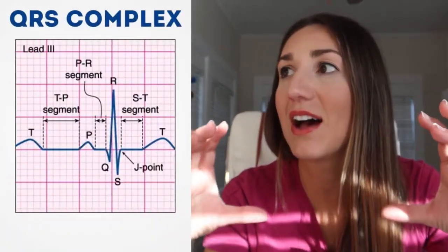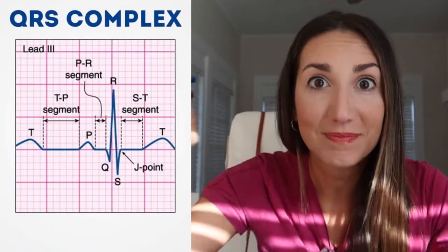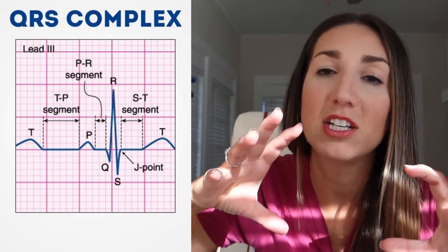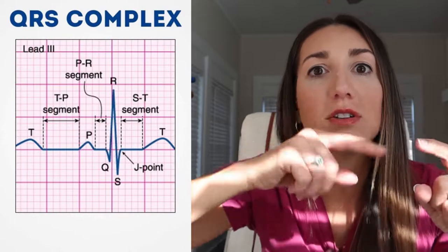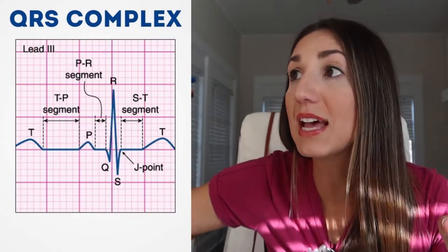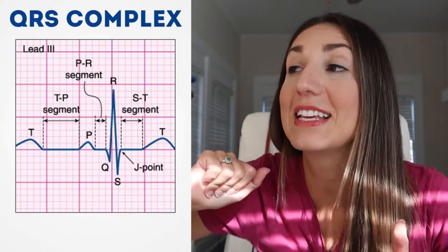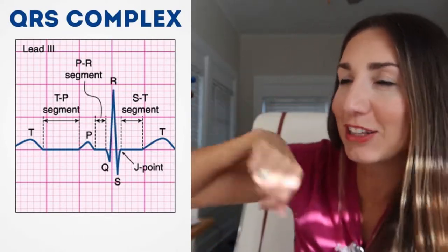So let's get started. I have two really quick graphics for you that I'm going to share with you within this video, and we're going to start with quick EKG reading. We're going to look at the actual QRS rhythm, you know, the thing that everybody gets tattooed on them, and we're going to break it down, and I'm going to teach you what each little interval and thing represents, and also how to count the rate and things like that. So I'm going to look at the graph, okay?